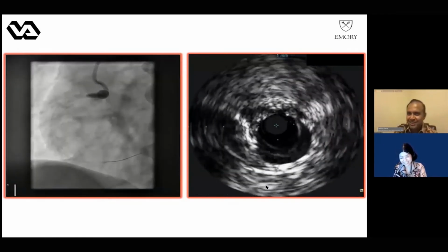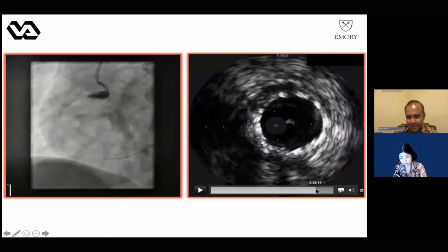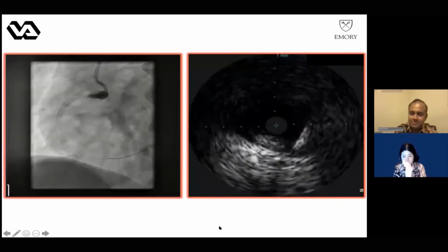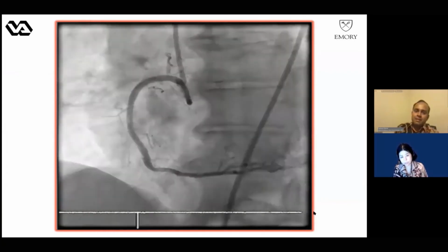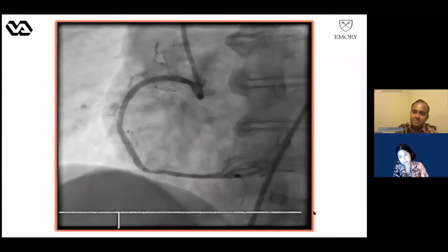Believe it or not. Let me see. Yes, this is interesting. Let me go frame by frame. Go to the very, very end. Yep. Okay. But I think it's okay, because as I said, typically the hematoma should have an entry side as well as an exit side. And I do think the entry side in this case should be the distal, because you make the dissection from distal to proximal. Therefore, I think you already covered the entry side.